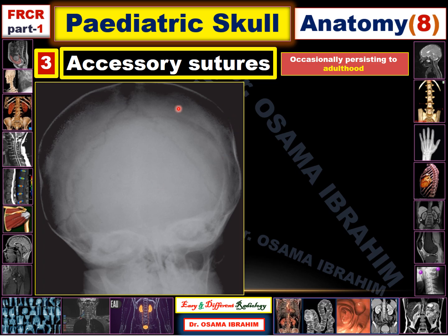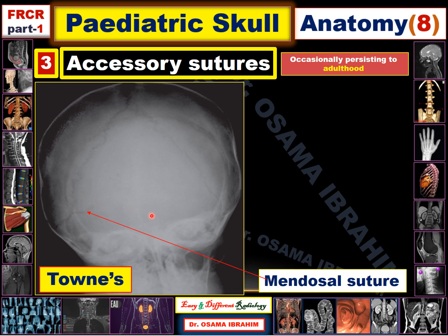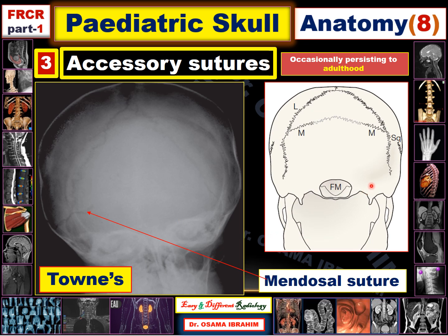The third accessory suture, occasionally persisting into adulthood, is called the mendosal suture. In the Towne's view — where the orbit is not clearly seen — sutures extend medially from the lambdoid suture on both right and left sides. This medially extending suture is the mendosal suture, which extends from the lambdoid suture posteriorly and medially. It can be seen in both the Towne's and anteroposterior views extending medially, and in the lateral view it appears extending posterior to the lambdoid suture. The Towne's view also shows the foramen magnum.